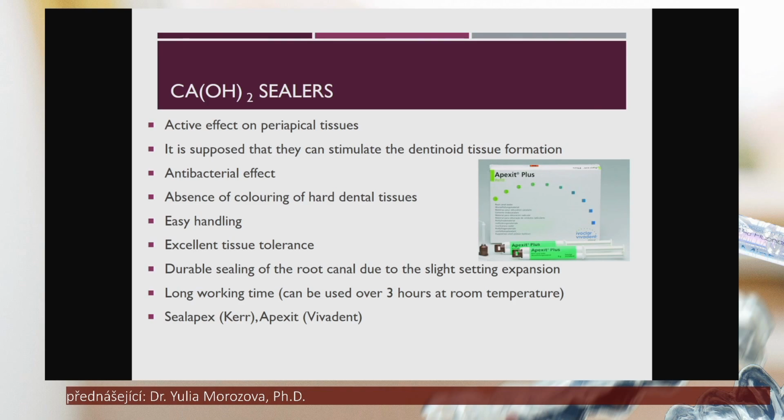They also provide durable sealing of the root canal due to slight setting expansion, and have a long working time, up to 3 hours with respect to time of hardening. But some authors said that these materials are not so volume stable and could be resorbable in the root canal. Like representatives, we can say about Sealapex and Apexit materials.